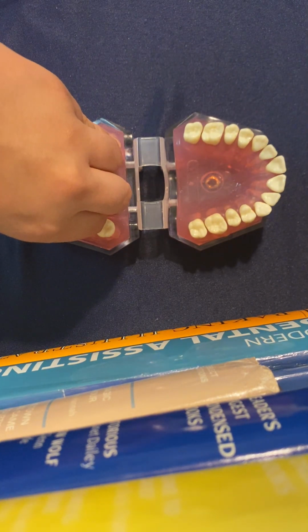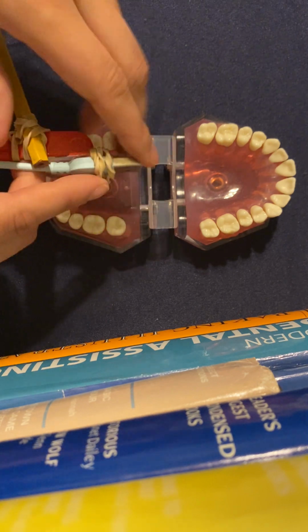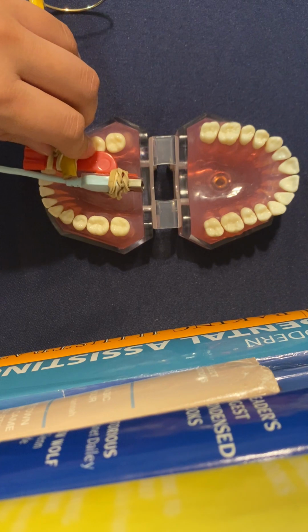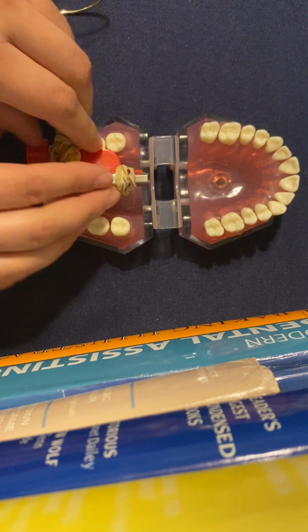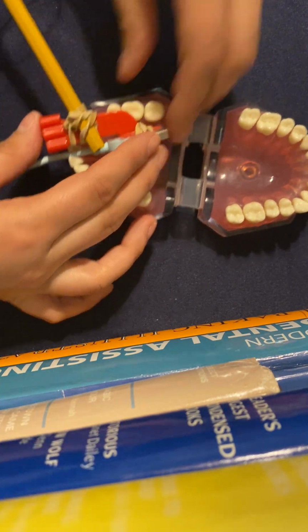Next, we're going to do the bite wing right molar. You're just going to push this one a little back, a little further. You're going to want to place the anterior edge at the middle of the mandibular second premolar. So you're going to want to line it up like this.